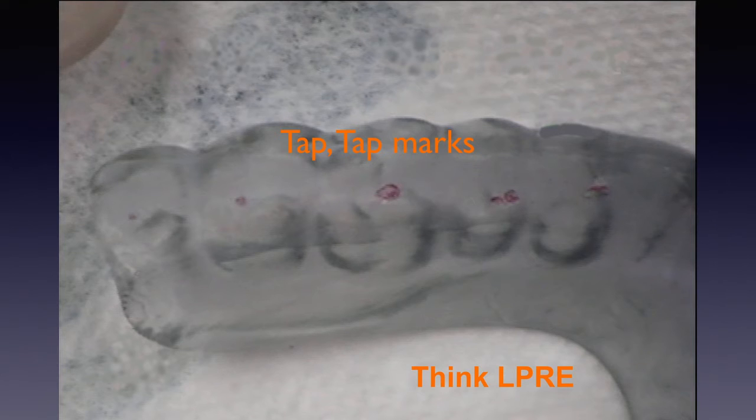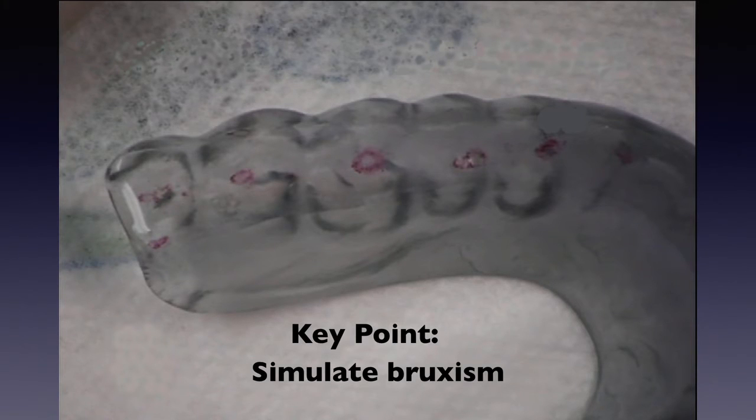They represent her last postural requirement engram. By simulating bruxism, a much greater load is applied and the more distal marks become more apparent. Whether the engram is overwhelmed or not, I don't really know, but it at least is encroached upon.